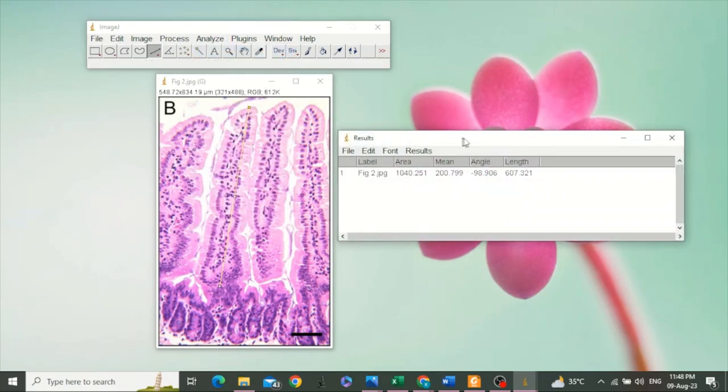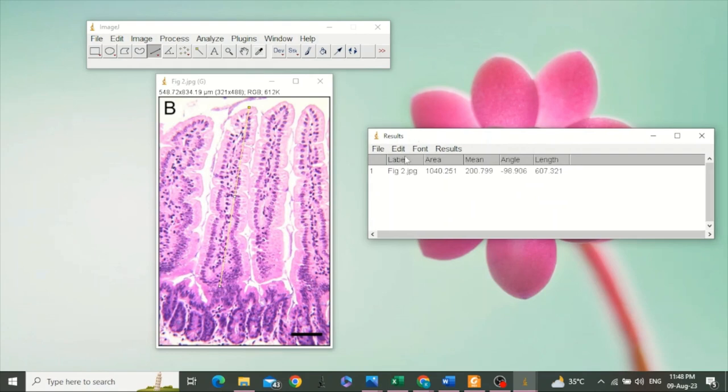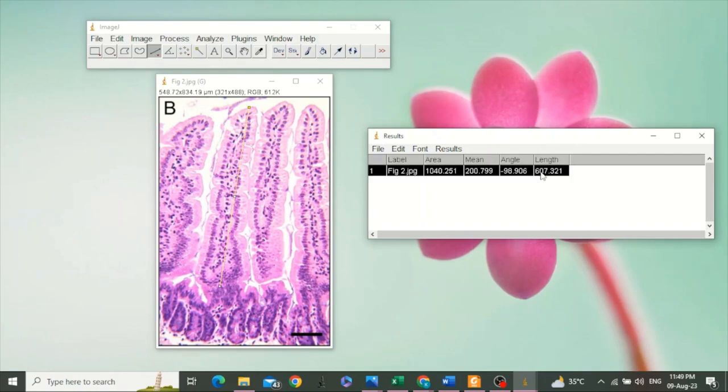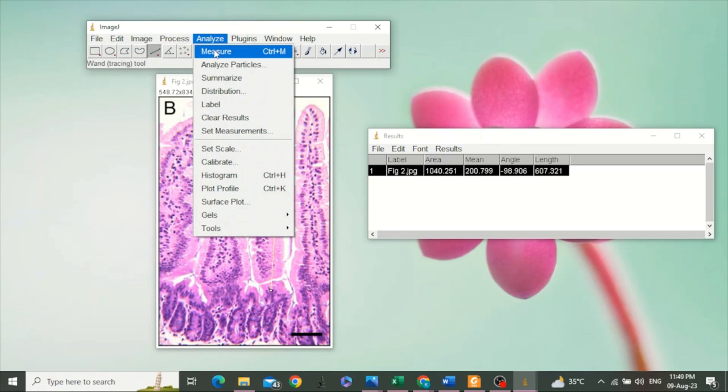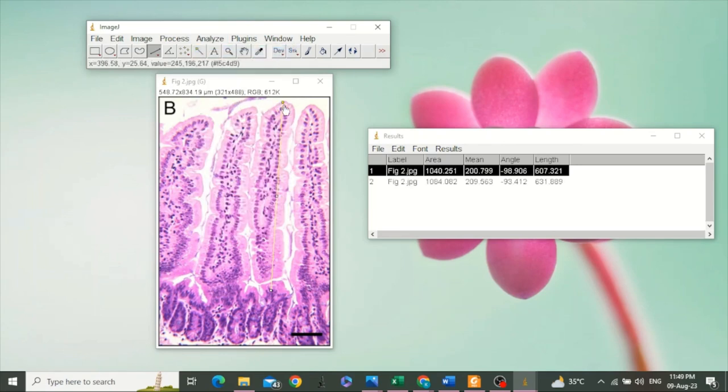You can see the results, which shows the label, area, mean, angle, and length. We are basically interested in the length of this villus. You can take multiple readings with multiple villi. Go to Analyze, click Measure. Another reading has appeared. We are not interested in these values at all at this moment.